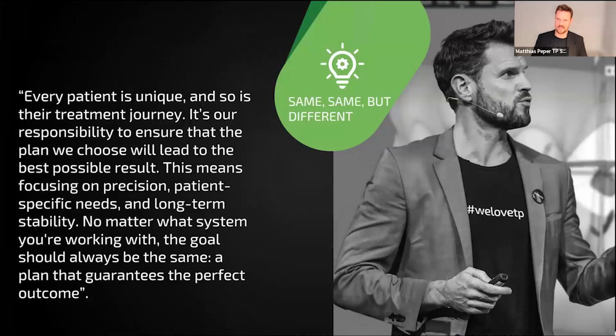We have realized that every patient is unique, and so is their treatment journey. So it's our responsibility to ensure that the plan we choose will lead to the best possible results. This means focusing on precision, patient-specific needs, and long-term stability. For us, no matter what system you're working with, the goal is always the same: a perfect plan that guarantees the perfect outcome. So this should always be the goal for digital treatment planning.